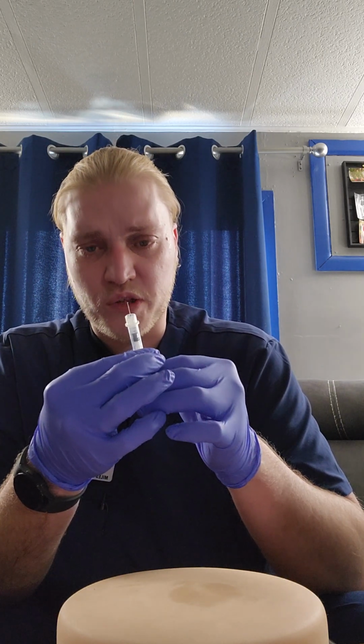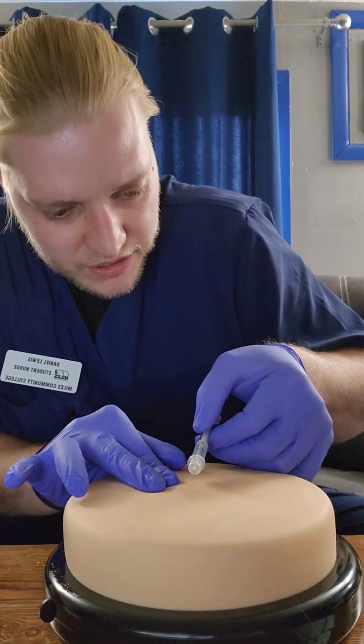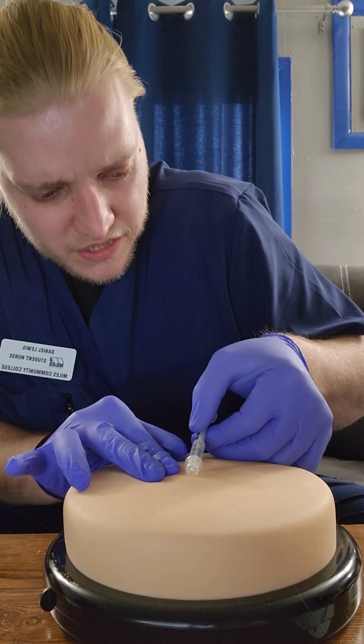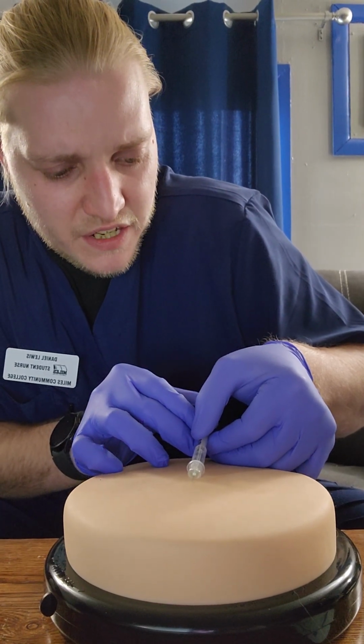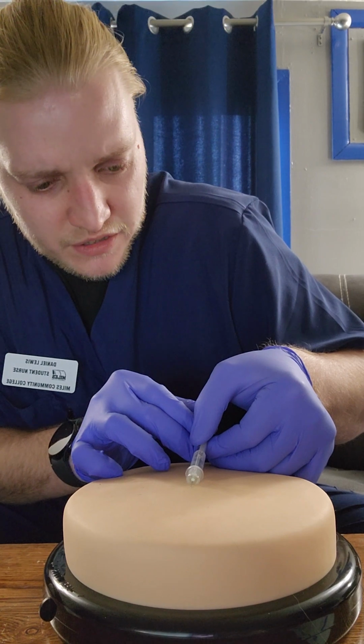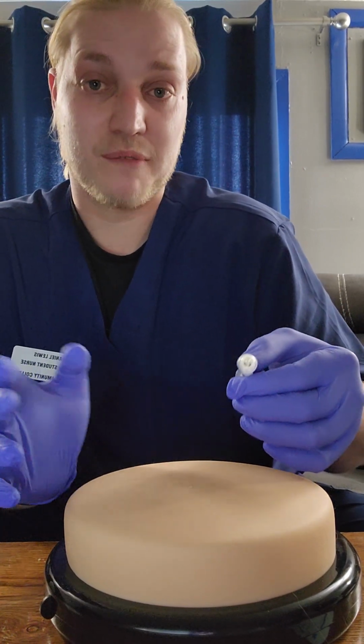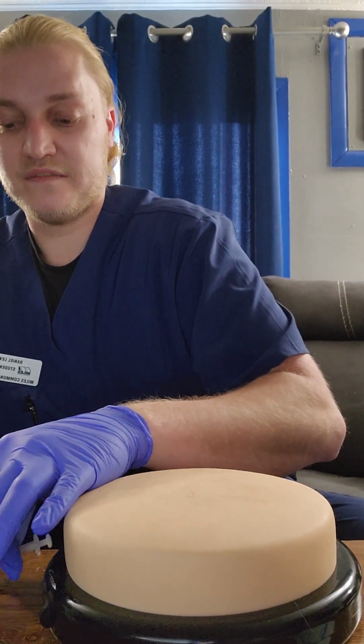And while it's still drying, I'm going to uncap the needle. And with this type of injection, I'm going to make sure the bevel is up, and I'm going to hold the needle between a 5 and a 15-degree angle. So I will pull the skin back slightly, making sure the bevel is up, and I will insert the needle about 1/8 of an inch, just enough to get that bevel under the skin, and then I will slowly inject the medication, which will cause a slight wheal. Well, it just popped with this thing, but it would be under the skin.